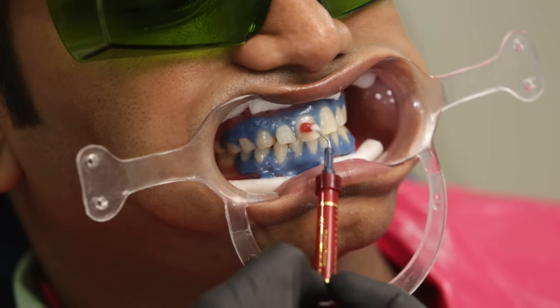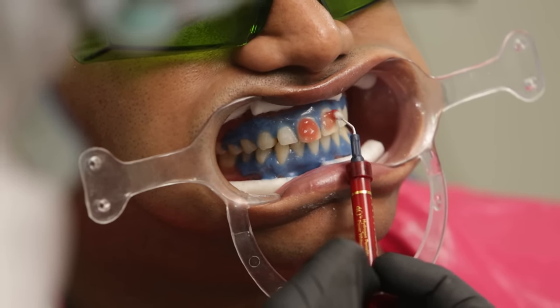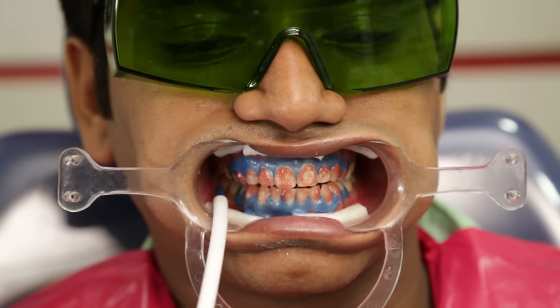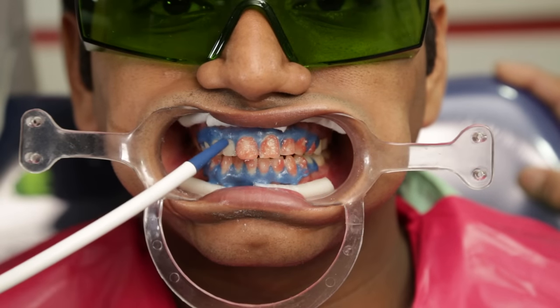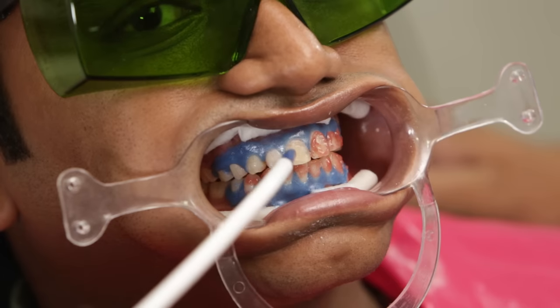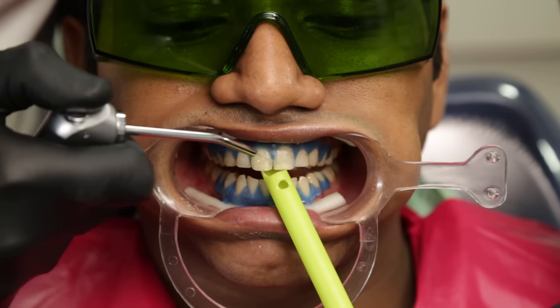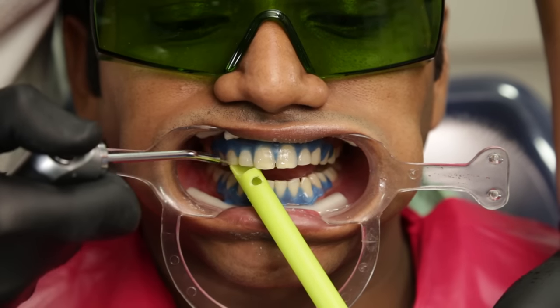The gel is then applied to the labial surfaces of the teeth in layers approximately one millimeter thick. The gel must remain on the teeth for at least 15 to 20 minutes before repeating the application. We also intermittently and closely monitor the patient to ensure that there is no bleach contacting the soft tissues. After around 15 to 20 minutes we remove the bleach with suction only — it's better not to use water at this stage to prevent splattering. The bleaching agent is a highly caustic solution and may lead to severe soft tissue burns, so it is very important to have a good high-volume suction for this procedure.